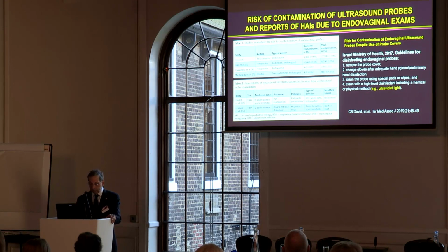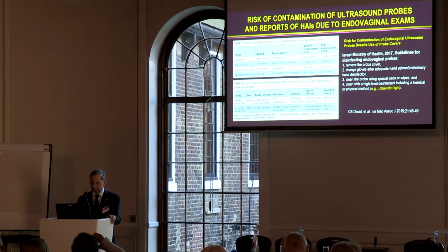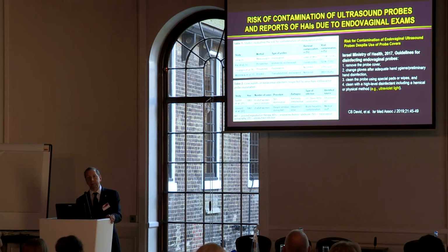You can see here they did note in studies, they did quote our study, the meta-analysis with these estimates. But again, this is just one of many studies in the literature. You can see they have 2 prospective studies and a blinded study demonstrating substantial bacterial contamination, 3.4%, and for viral contamination, you can see anywhere from 1.5 all the way up to 14% when evaluating the risks of contamination.